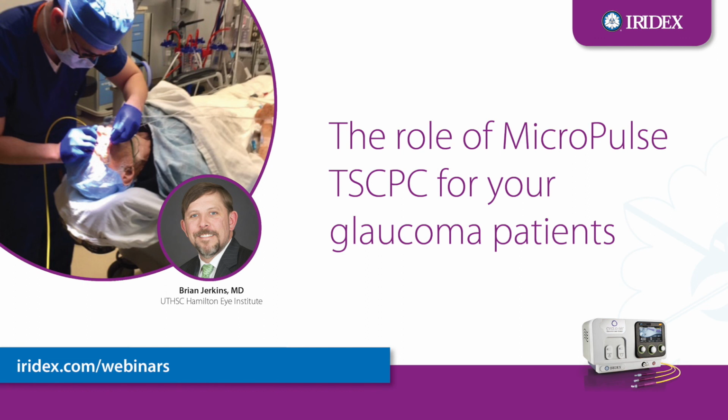With the conjunctiva, I would say in some patients it does tend to be a little bit more scarring near the limbus, but not anything that's significant in my experience. I think some of them in the previous with G probes was a little bit more concerned for some conj scarring, but it's something to be aware of. The conj itself being friable, I don't see that as a difficulty, but some of the limbal conj in a few instances can be a little bit harder to initially mobilize.